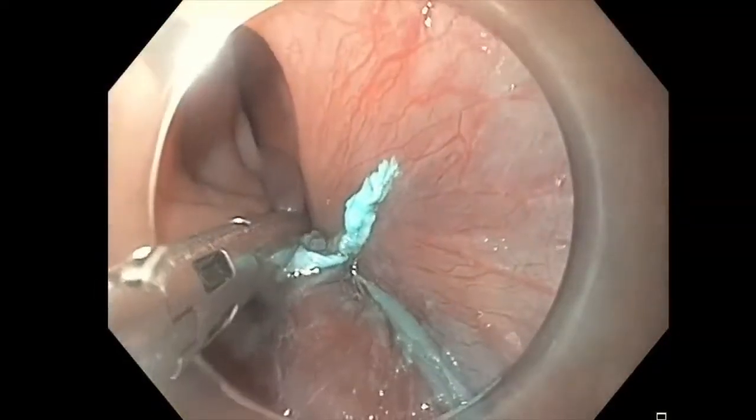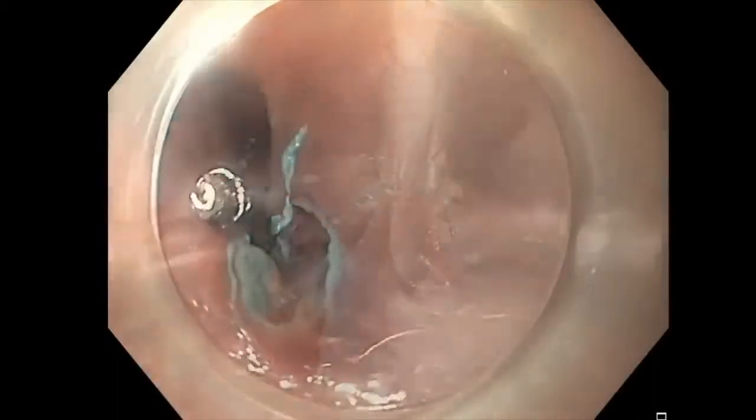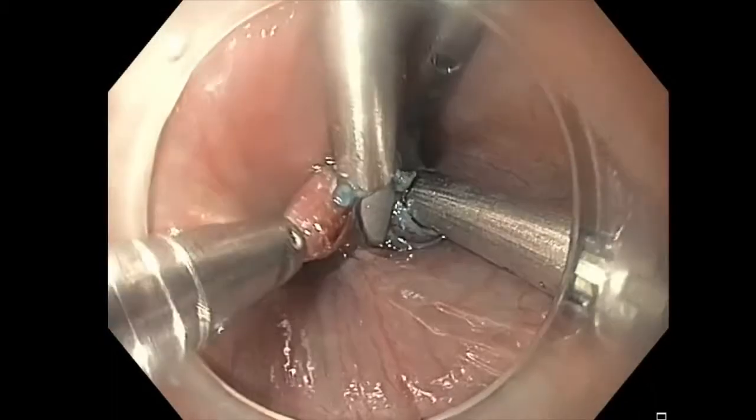Finally, the mucosal incision site is closed with through-the-scope clips. Clips are placed sequentially in close approximation until the entire defect is sealed.